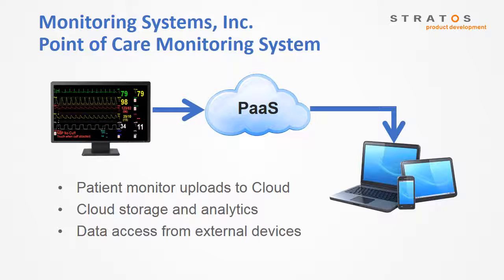The system will need to offer high measures of performance, 24/7 availability, and high reliability across several regions in the United States. This is a simple system now, but the company has big dreams. They know that the cloud can send information in both directions, and their plan is for their next monitoring device to provide a real-time video window for remote caregiver consultation. They also want the system to support over-the-air software updates and remote configuration.